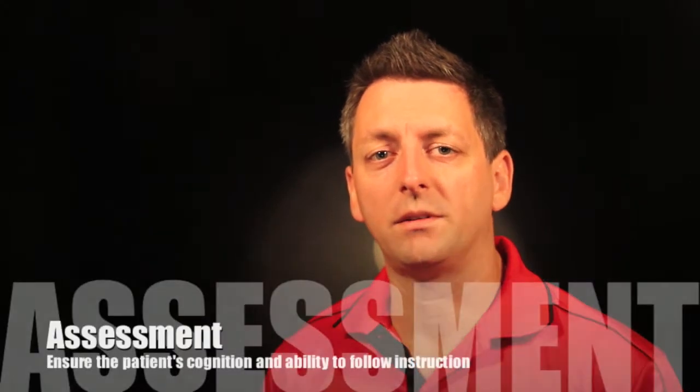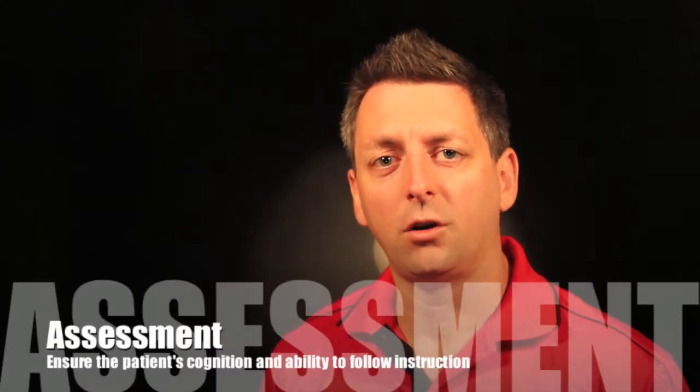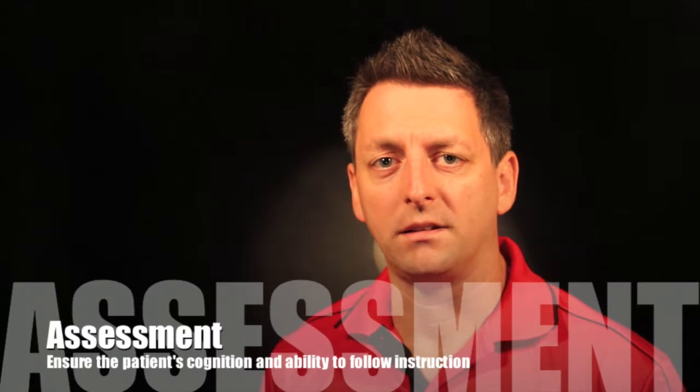So where do we start? We always start with a good assessment. So assess the patient. Are they cognitively able to follow commands? Now, they're not a healthy person if you need non-invasive ventilation, are they? They're going to be tired, short of breath, anxious, even a bit agitated and aggressive, start plucking at things, pulling things off.